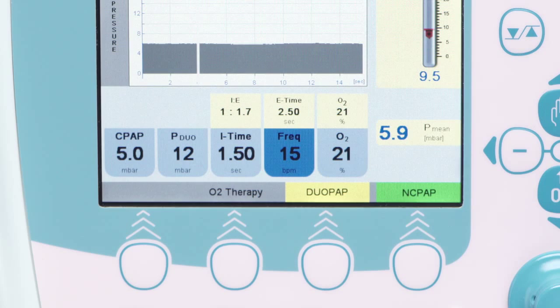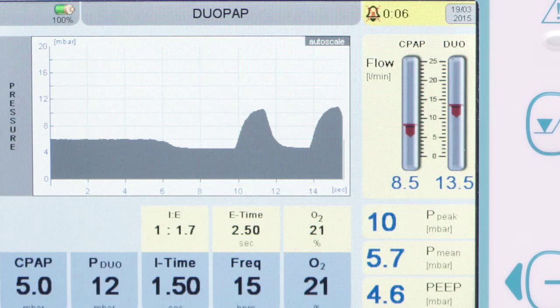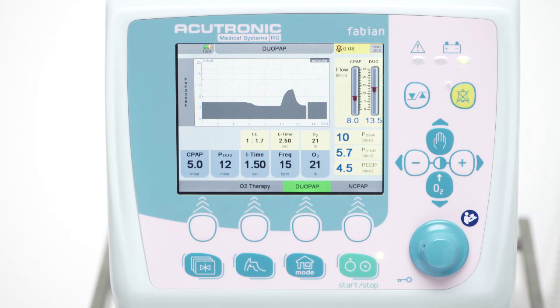In DUO-PAP, Fabian will automatically adjust the two flows for the two different pressure levels and display the used flow amount for each level.